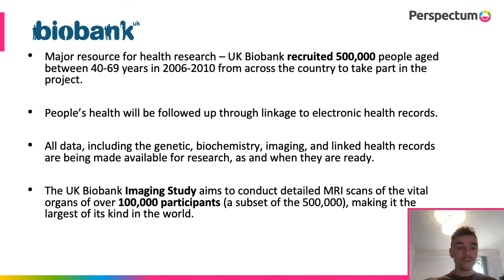UK Biobank contains an imaging sub-study which aims to conduct detailed MRI scans of around 100,000 participants, making it the largest imaging study in the world.